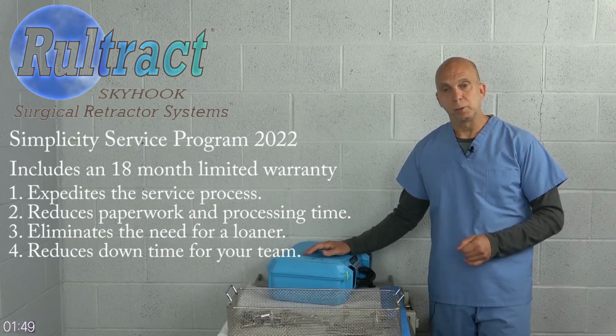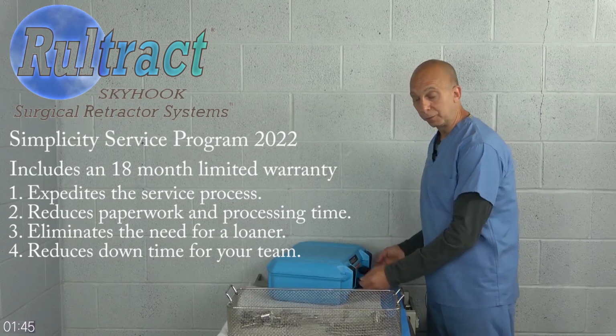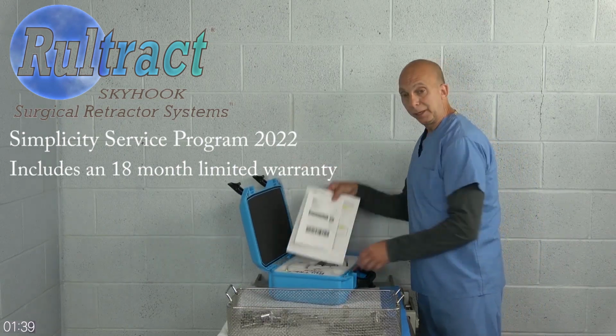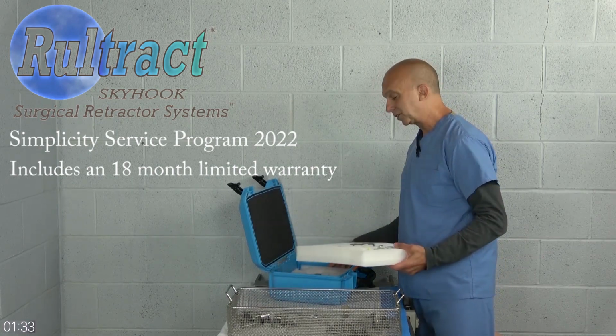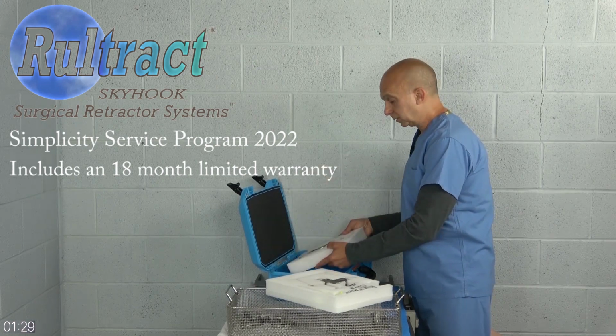Now, when this piece of equipment arrives at your facility, you're simply going to, as I said, remove it from the case. Push the tabs, open the case, take the paperwork out, and then you're going to have your Rultract in a foam insert. Now, if you've requested two, there'll be another foam insert underneath.